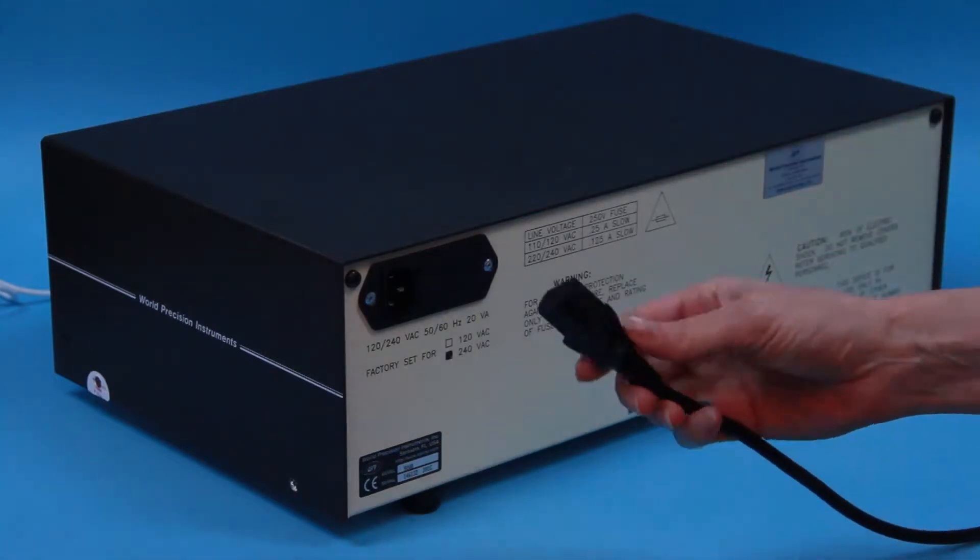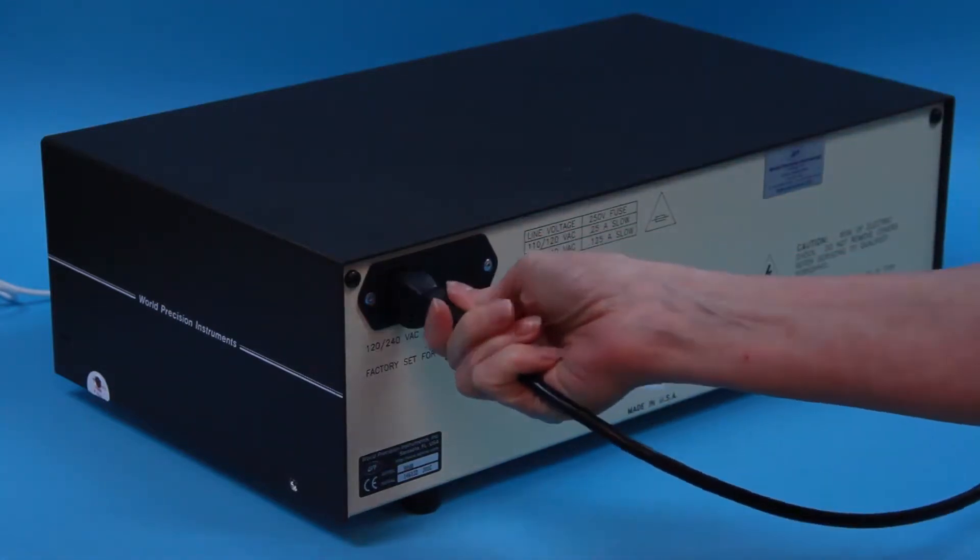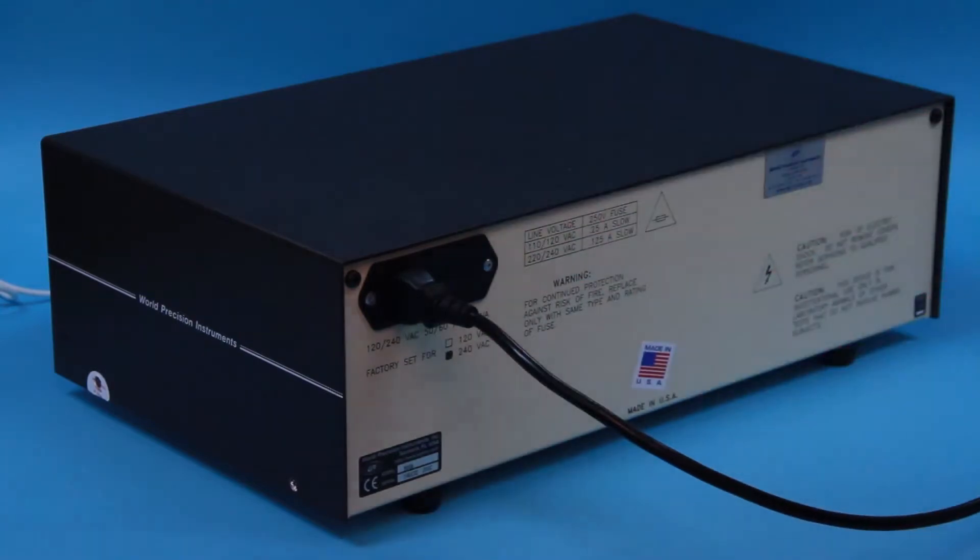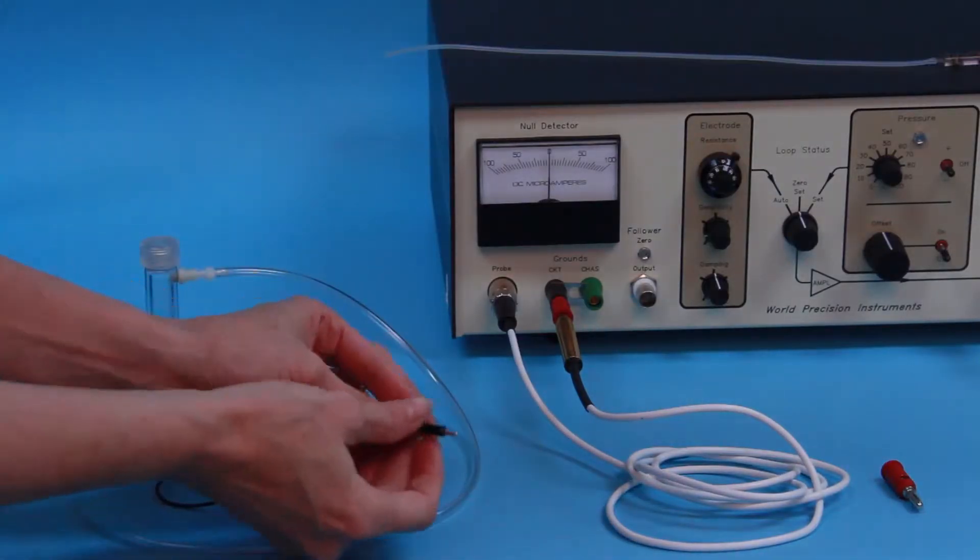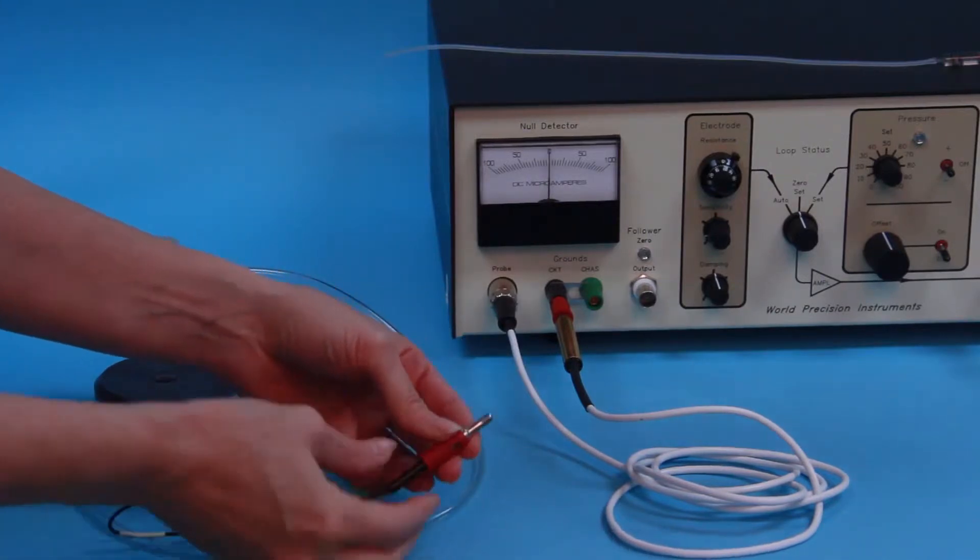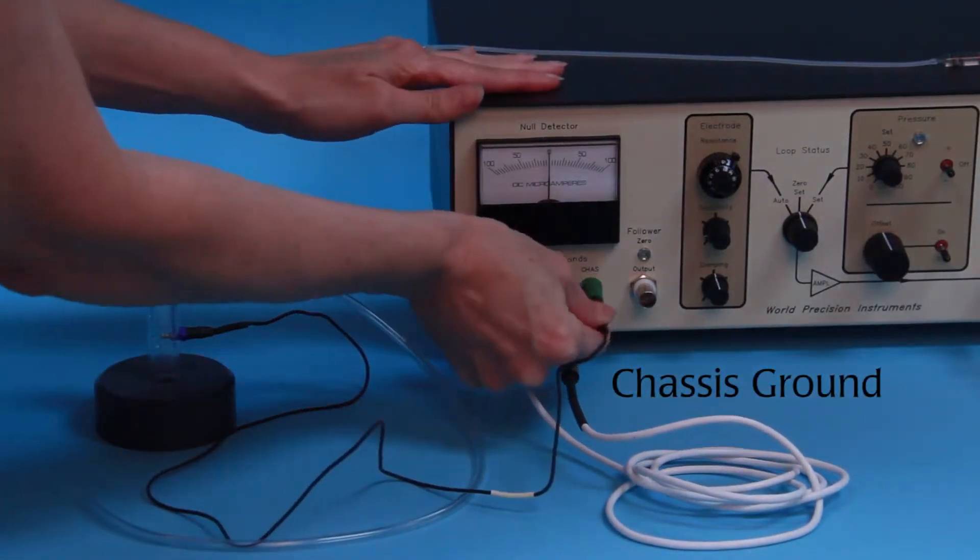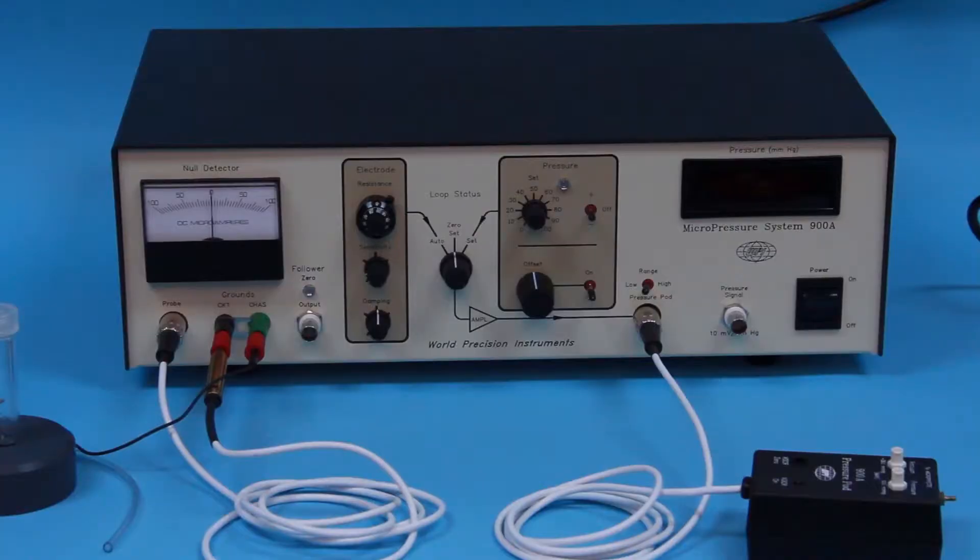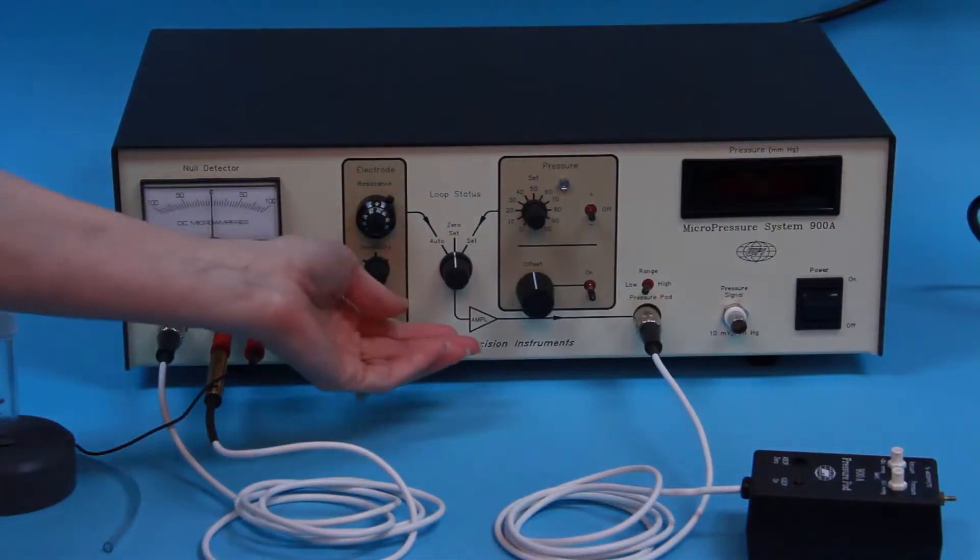Connect the power cord to the receptacle on the rear panel of the control unit. Plug into the wall socket. Connect the reference electrode from the Cal 900A, or the experiment, to the ground terminal marked CHAS on the front panel of the control unit. Place the loop status in the zero set position.